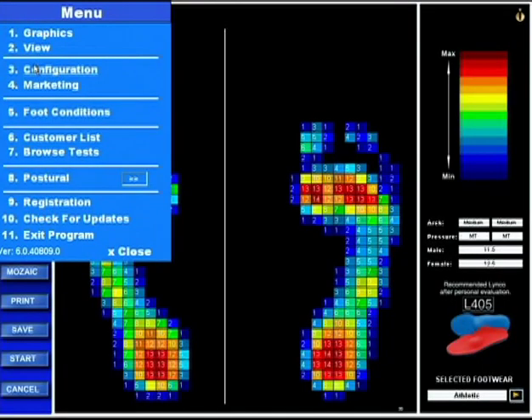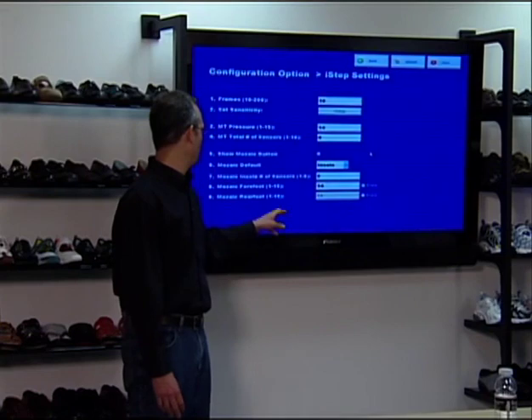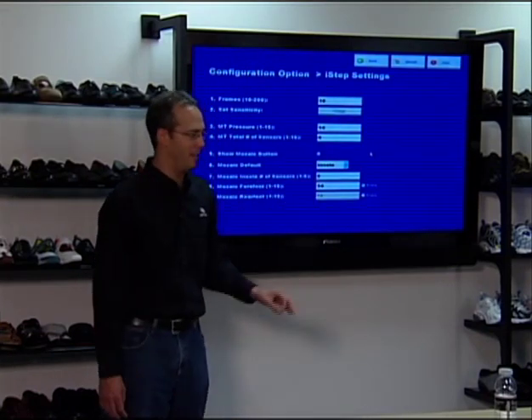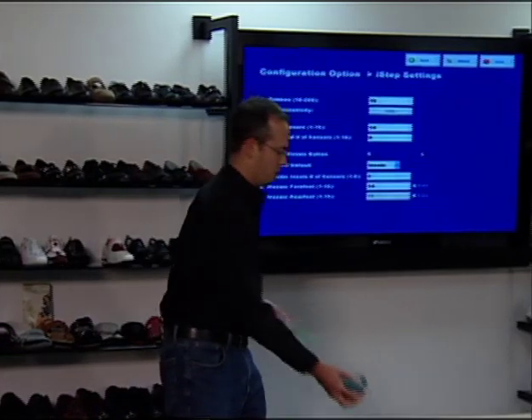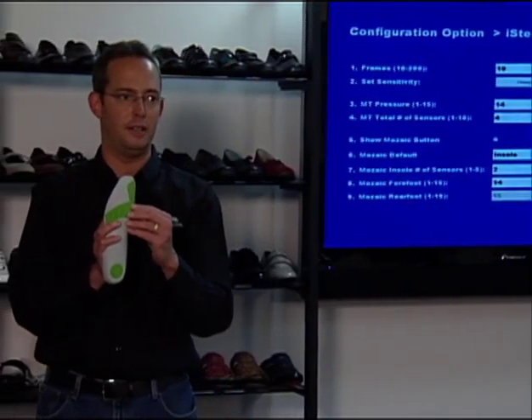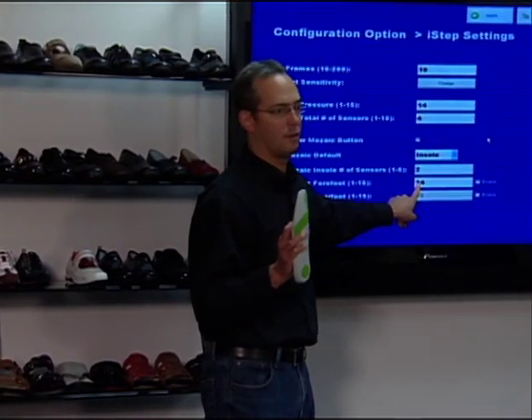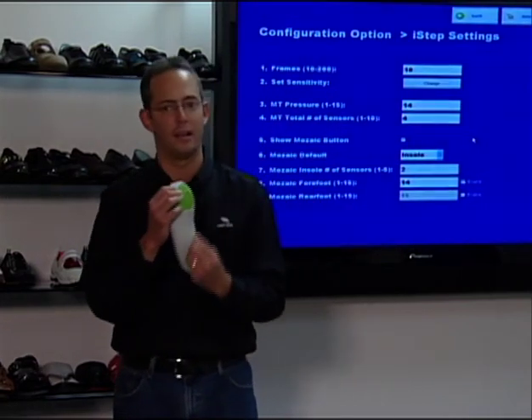We go back into Menu, Configuration, Number 1. We now have the default set to the insole. Mosaic insole number of sensors: 2. The number of sensors for the mosaic insole means we're telling the machine it has to have two sensors in a row at 14 or higher to indicate that a mosaic gel plug has to be removed. This is similar to the metatarsal pressure section, where we had to have four in a row at 14.